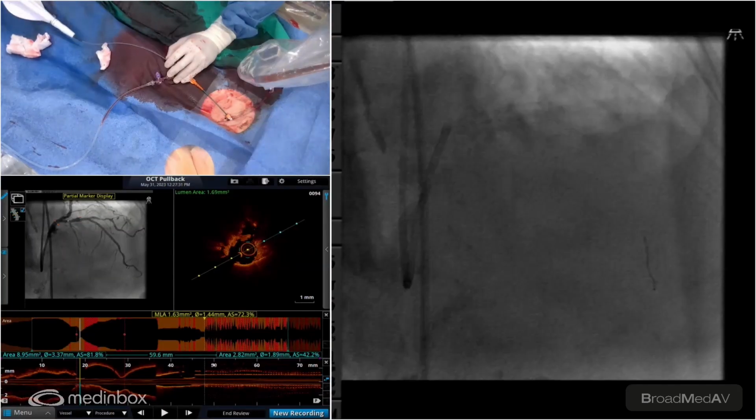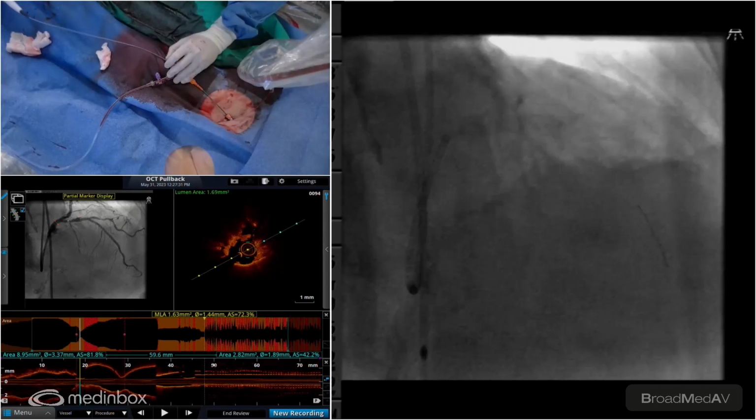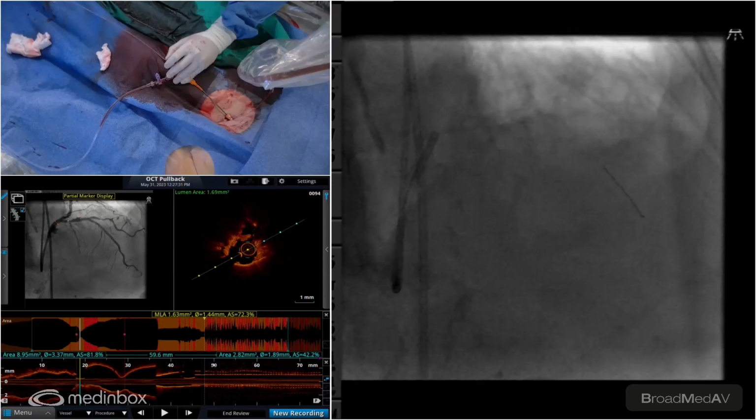You want to switch over to a workhorse wire or work on this guy? I think let's do a workhorse wire. It makes life a lot easier for me. Just push the wire in, push the wire in. There we go. Let's get the turnpike ready, please. Keep going.